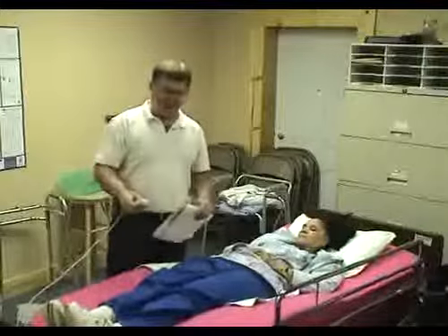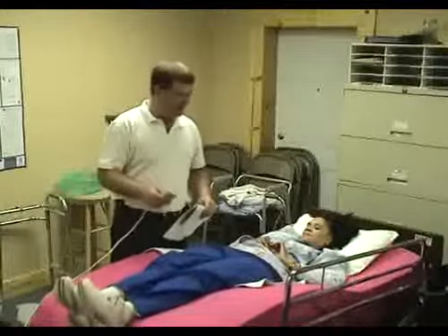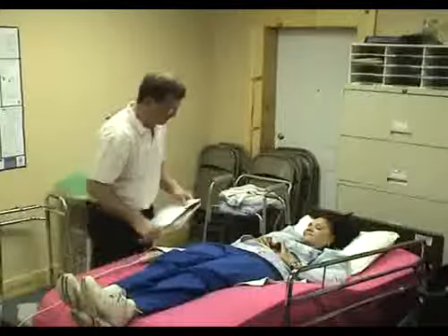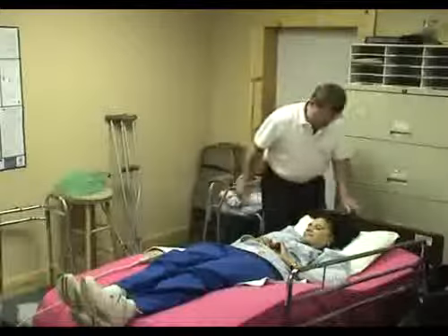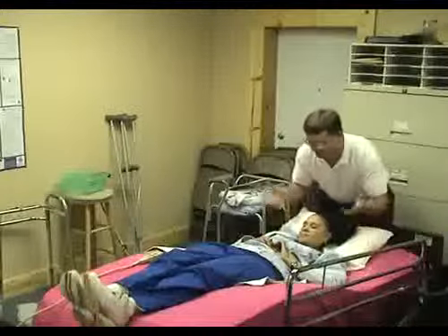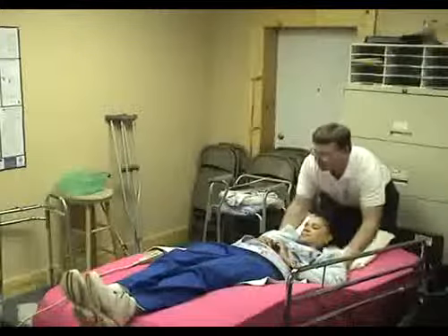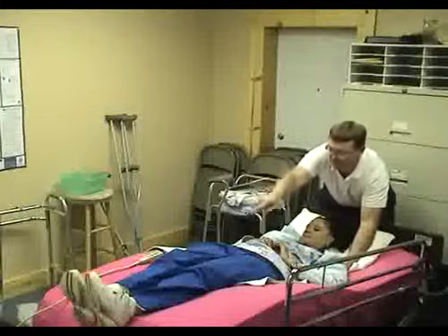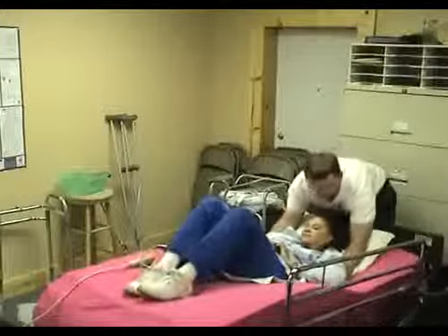But when a patient is too far down in bed and you're at home and you're by yourself, how do you get them up? You put the feet up. You're going to feel like you're standing on top of your head here for a minute. You put the head all the way down. If there's a draw sheet, you can use the draw sheet. If there's not a draw sheet, you just want to put your hands underneath their shoulders and you're going to pull her downhill. If they can help you a little bit, the best thing for them to do is to raise both of their knees. Raise both of your knees for me. This patient's a good patient.